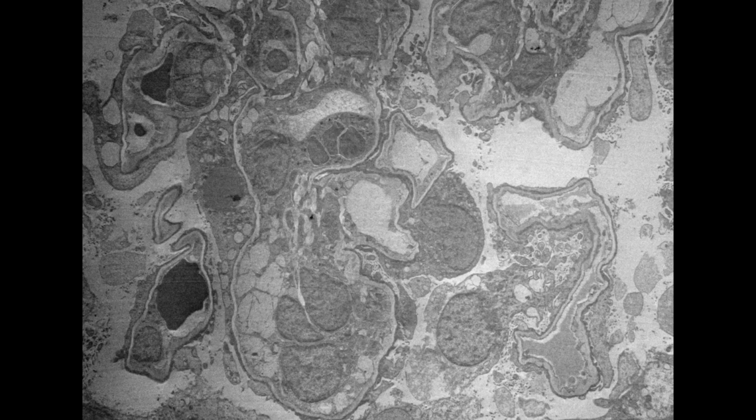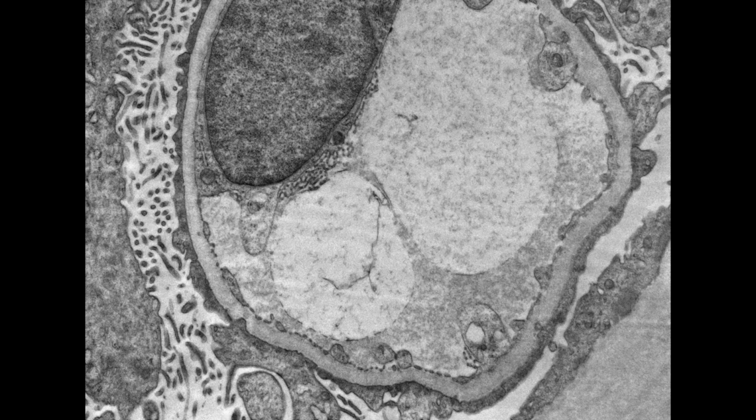So, what did the electron microscopy show? So on electron microscopy, we can see on low power that the basement membranes are uniform and of normal thickness. We don't see any deposits along the capillary loops or within the mesangium. But this is a higher power picture. We can see that there's diffuse widespread foot process effacement along the capillary loops. We can also see microvillus transformation.